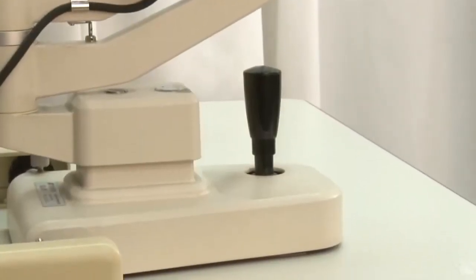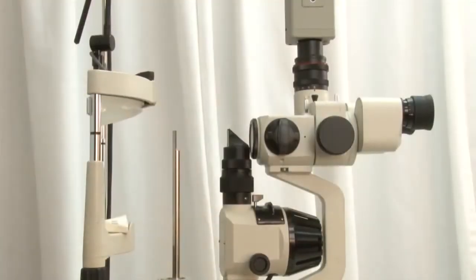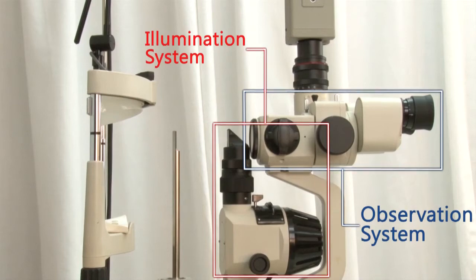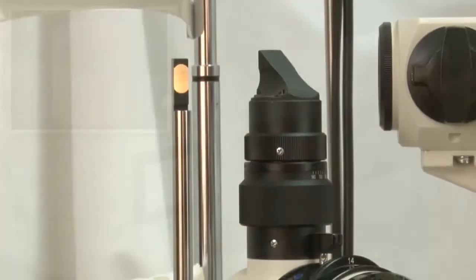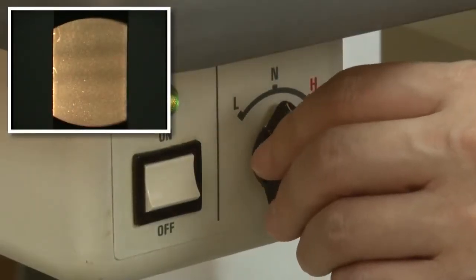This video will demonstrate how to use a slit lamp and perform different techniques. All slit lamps in the market have a similar design. They have two basic components, an observation system and an illuminating system. The illumination system provides a precise and adjustable source of light.